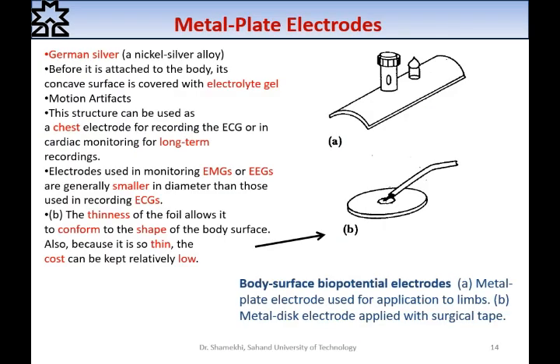In the next slides, by the end of this lecture, we will talk about the types of the electrodes. We will see some images, some examples, and we will review all types of the electrodes in brief.